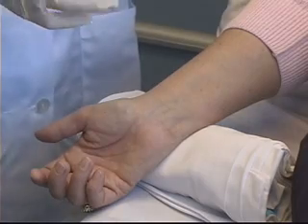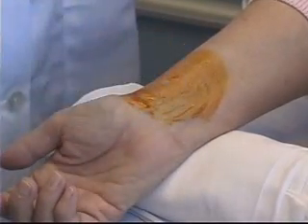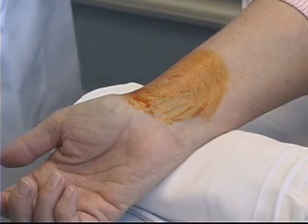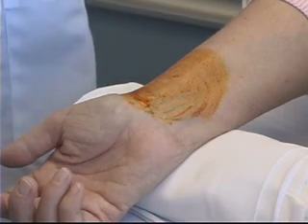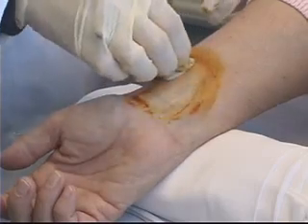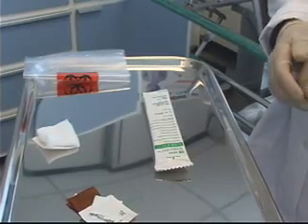The first cleaning is going to be with the Povidone-iodine, and I'm going to start in the middle and clean in a circular motion. After I've allowed that time to dry, my next step is to wipe away the Povidone-iodine with an alcohol swab.